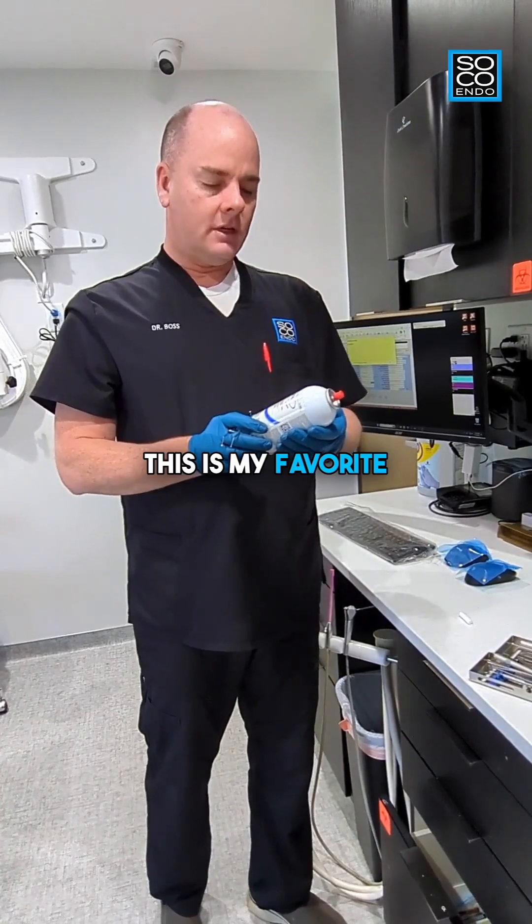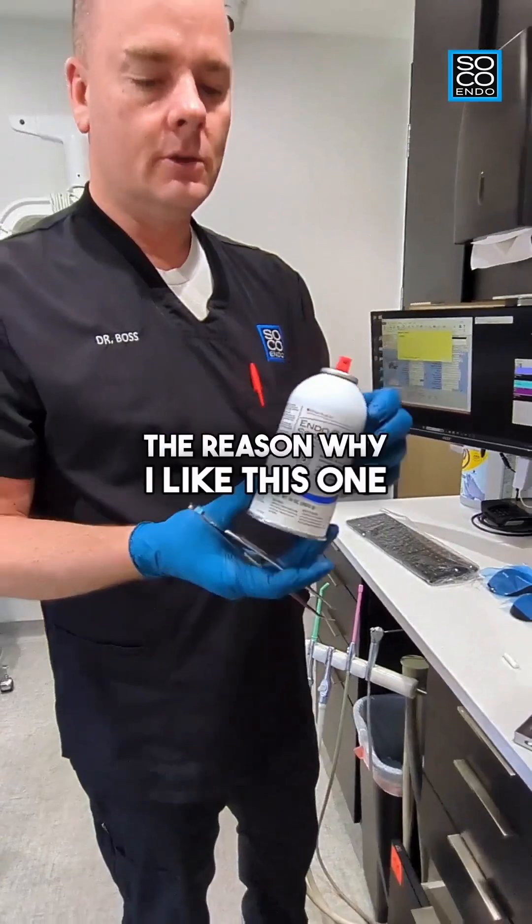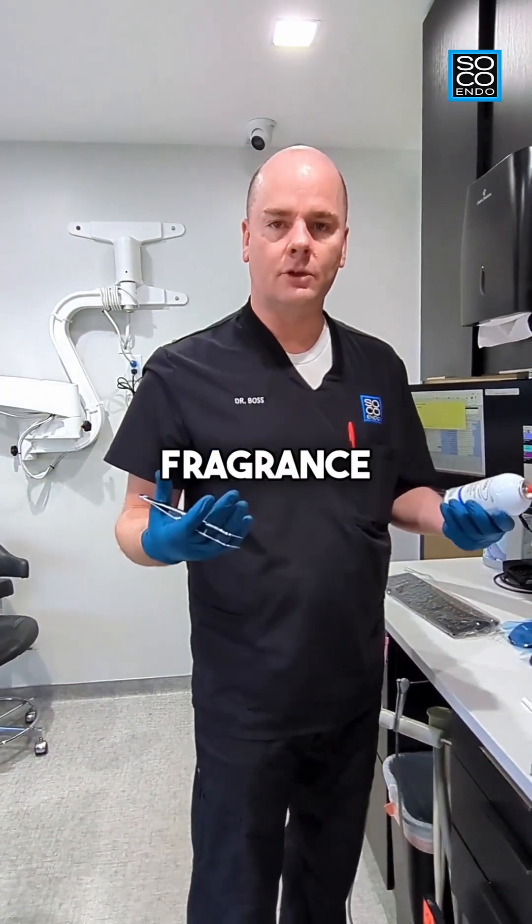This is my favorite cold spray. It's called Endo Cool Spray by Henry Schein. The reason why I like this one is because out of all the sprays, it has the best fragrance.